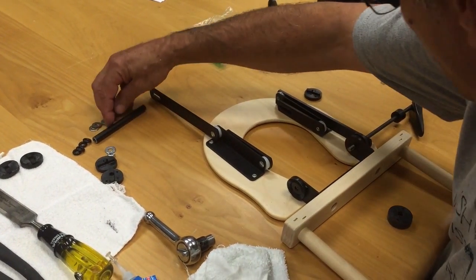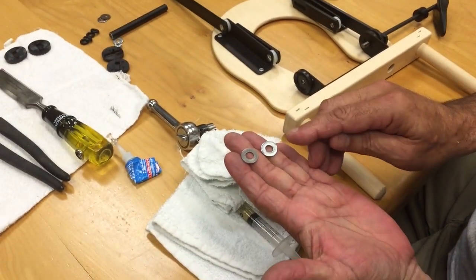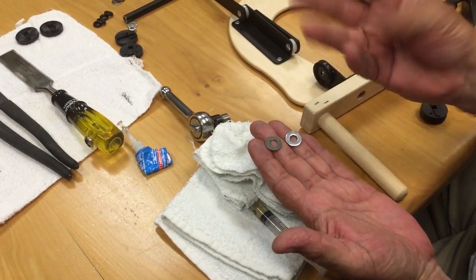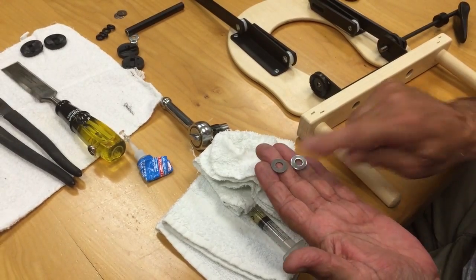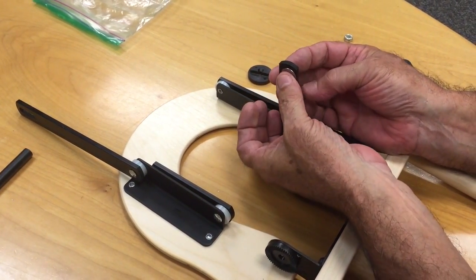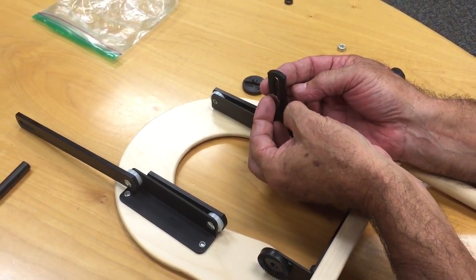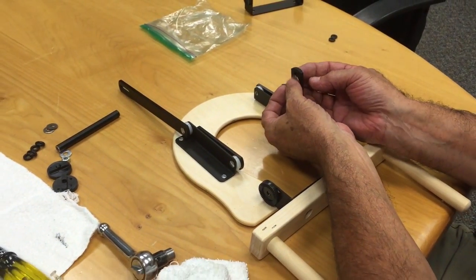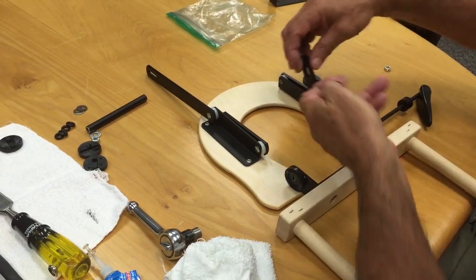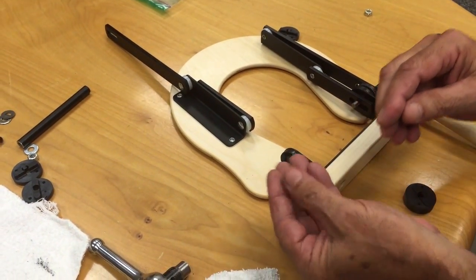your bracket, and then you would put one of the stainless steel washers, and there is 2 different sides. One is very smooth and shiny, and the other is duller and has more like a burr. It's not sharp, but it's much sharper than the smooth side. The smooth side must face this small bar. If this is in reverse, it will dig into this material and cause your FaceRest to have issues. So you need that to be the smooth side on each side. So that goes there. Smooth side going to be towards this sliding bar. Goes in there. Then the other smooth side towards the bar.